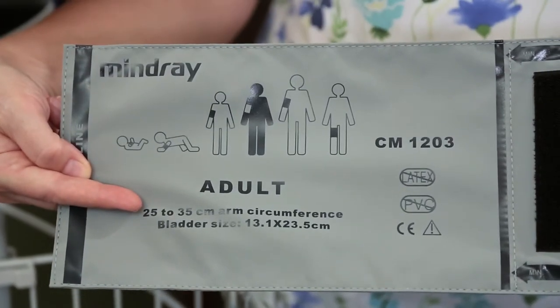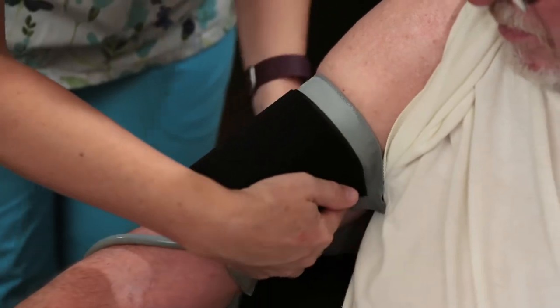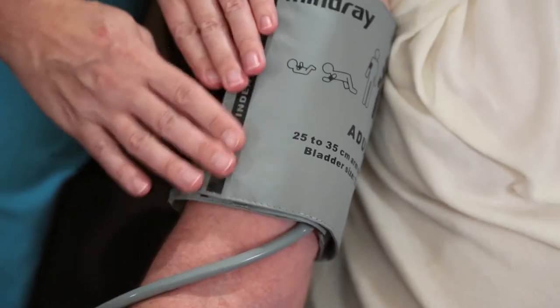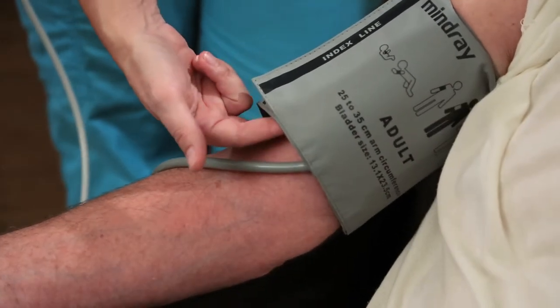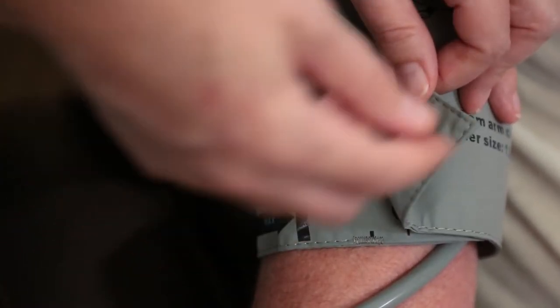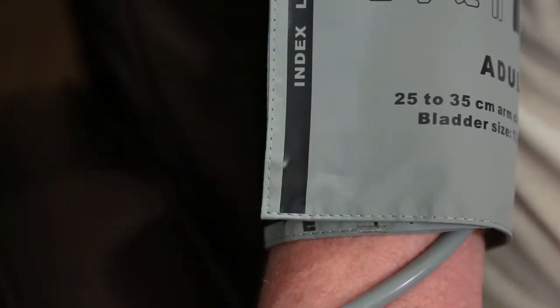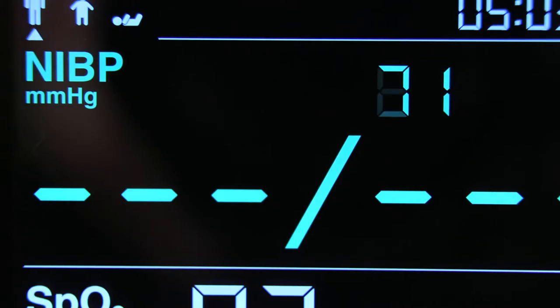Select the appropriate sized blood pressure cuff, apply the cuff to the patient's upper arm or thigh, and make sure the marking on the cuff is aligned with the artery. Do not wrap the cuff too tightly around the limb, as it may cause discoloration and ischemia of the extremities. Make sure that the edge of the cuff is within the marked range; if it is not, use a cuff that fits properly. Press the NIBP hard key to start the NIBP measurement.